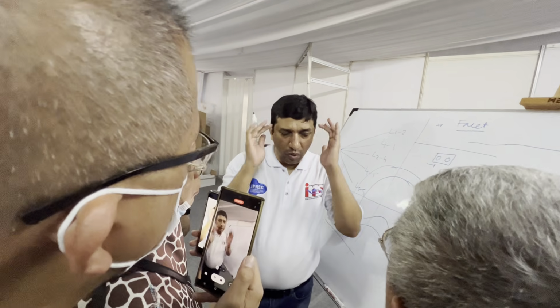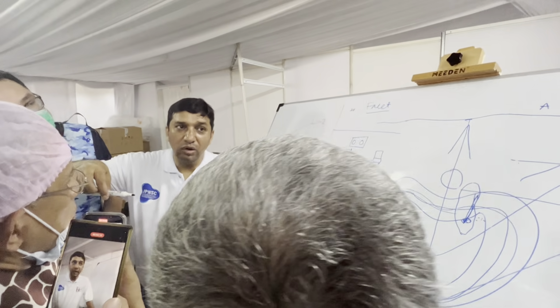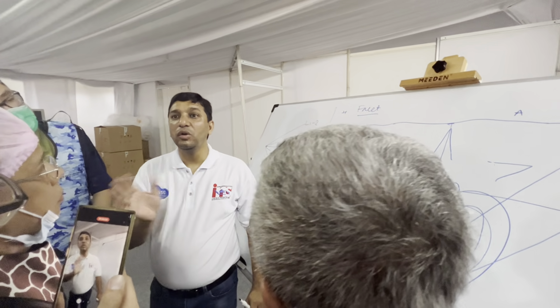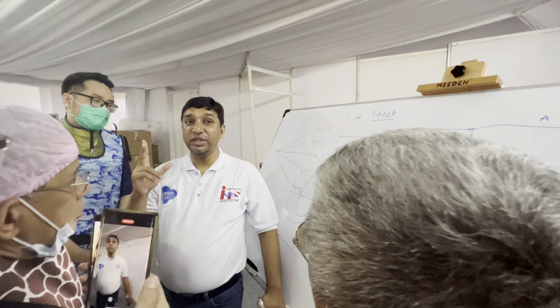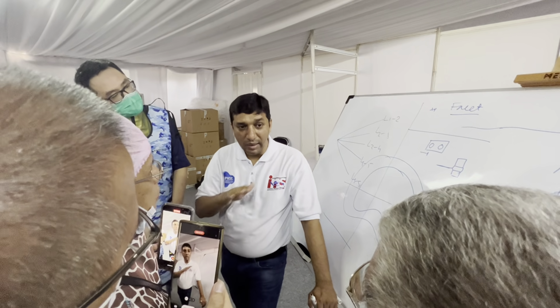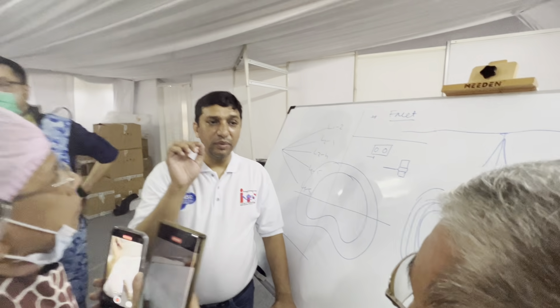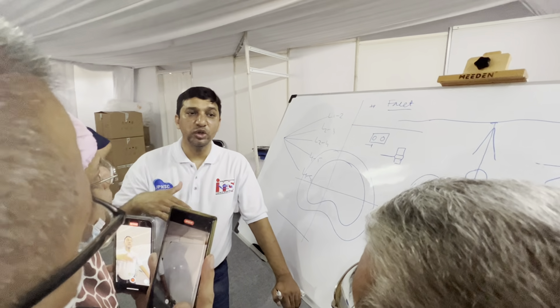These two views always correlate. If you show me one picture and ask what it is, I say I don't know, because if you put the needle above and take the AP view, it looks the same. Even if I put the needle in the stomach, it will look the same, unless you take the lateral view and realize, oh my god, this is inside and this is outside. So two pictures, AP and lateral, have value; one single picture doesn't. The lateral view gives you the depth and the AP view gives you the medial direction. First, you touch the facet. On the lateral part of the facet, on the X-ray, you should be touching the bone, and in the lateral view you should be posterior to the facet.